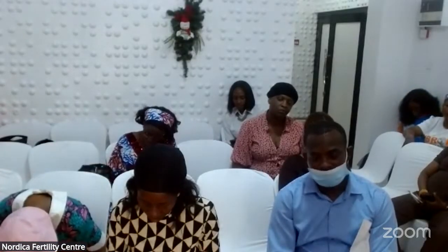Those who perhaps have had radiotherapy for whatever reason, be it intestinal malignancy or reproductive organ malignancy, you don't want to do HIFU in those people. Or someone that cannot lie down for at least 1 hour, maybe because of a back problem, you don't want to recommend HIFU in those people.